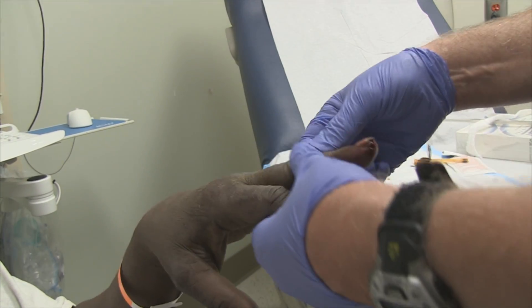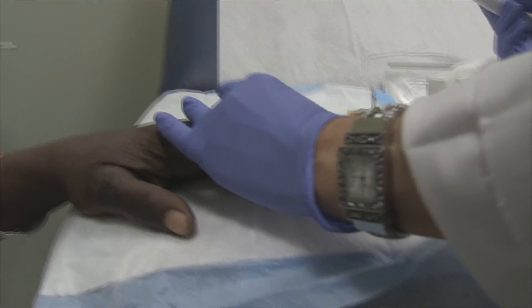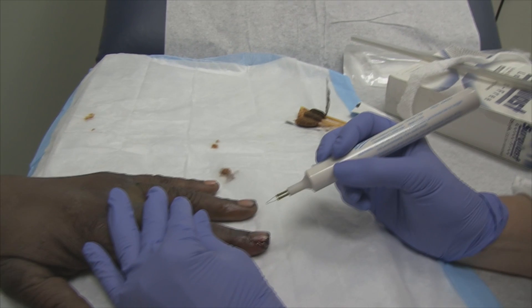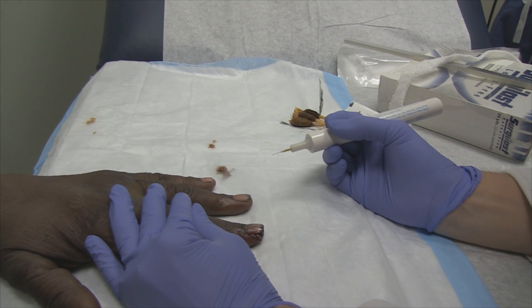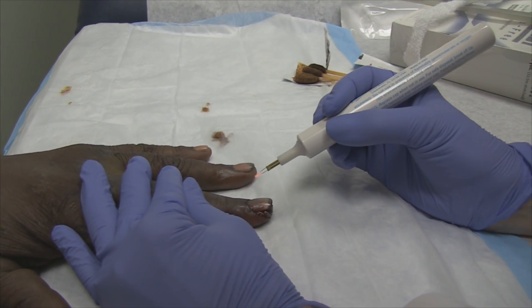The next thing we're going to do is a nail trepanation. You're going to have to put your finger right here — have you lay down. He can't feel burning or pain, so what you're going to do is just touch it and come off. Touch and come off — because he can't tell you if it's burning badly.